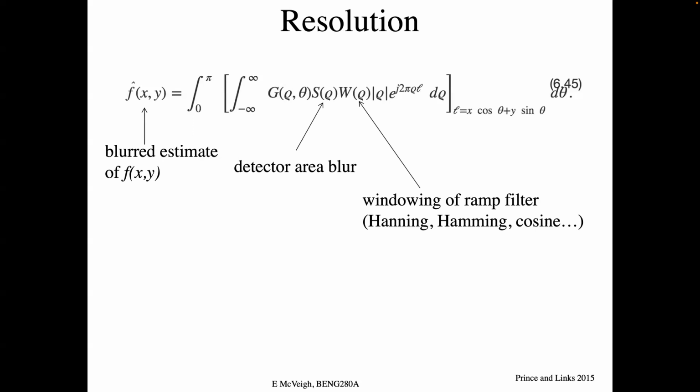So obviously, if that thing is broader, our spatial resolution goes down, right? If the detector is narrower and narrower, we can see a narrower and narrower space. We're sampling at a higher frequency in that theta direction. Our spatial resolution goes up. However, the number of photons per unit time for the same dose drops for each detector. So there's a balance, and there's also a balance in cost of just making that many individual receivers and amplifiers, etc.